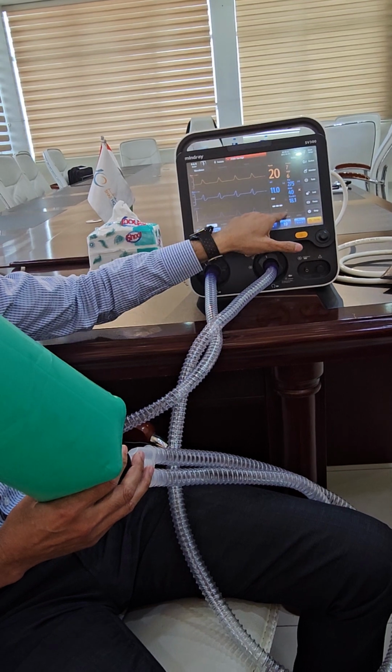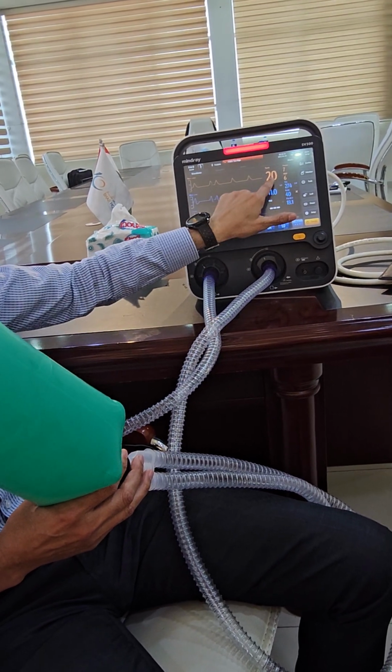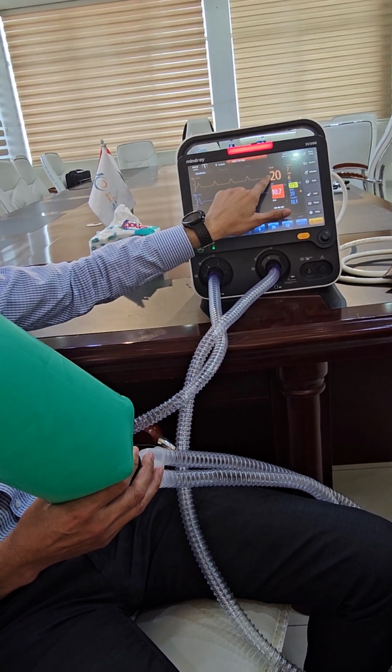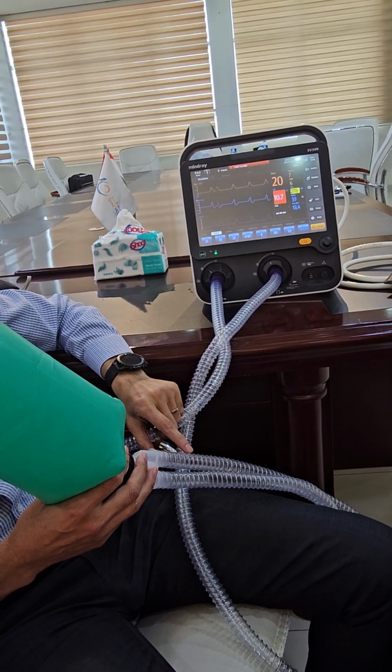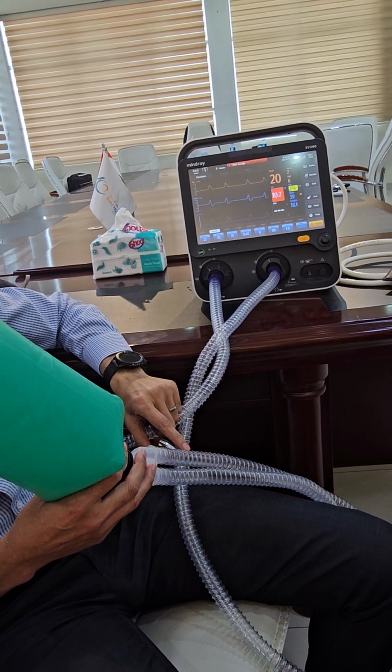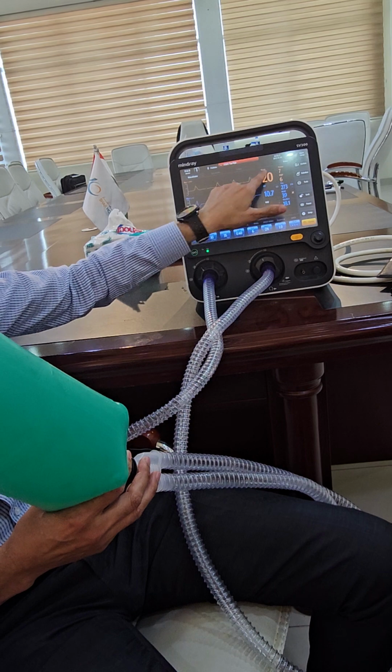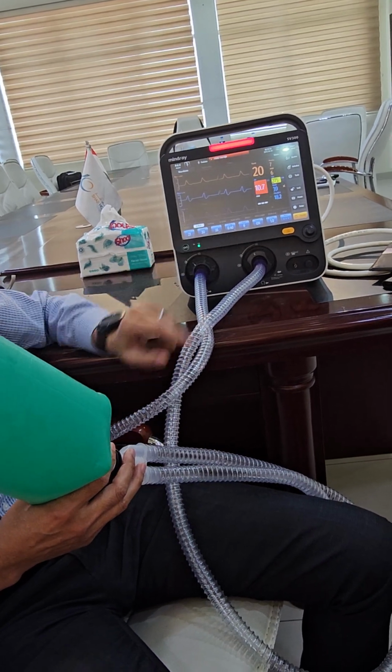I don't expect you to know everything. We know this. What's this one? P peak: how much the machine is giving. The pressure peak, how much the ventilator is giving. It's a result of this and the patient interaction to achieve the accepted tidal volume.